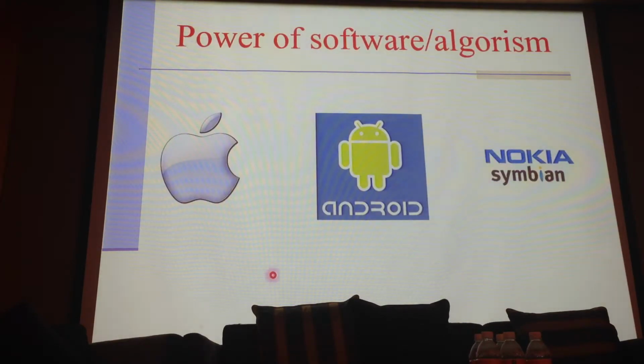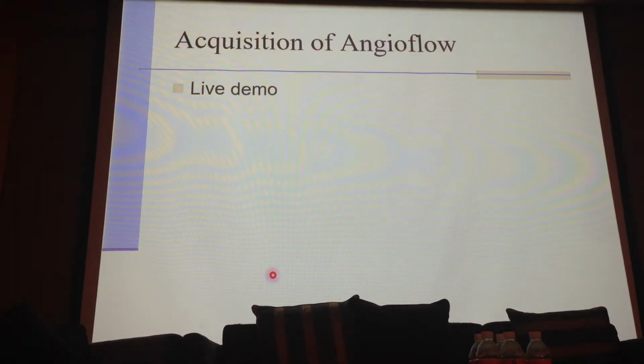I remember yesterday one doctor asked which OCT should be his choice when he chose the OCT from so many manufacturers. My answer is I'm not telling that Optovue is the best choice, but always try to look into the commercialized device with best software and algorithm. Thank you. And right now, I'd like to show the live demo with the device.